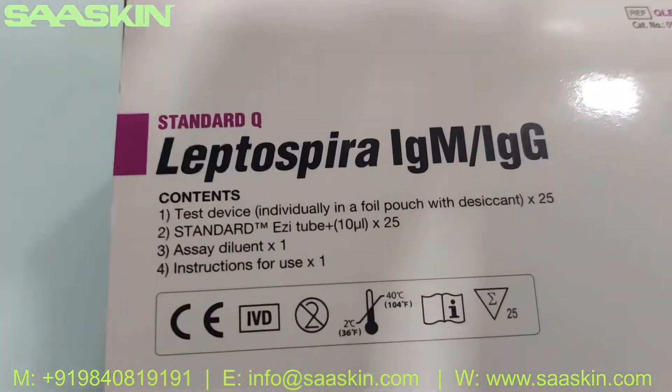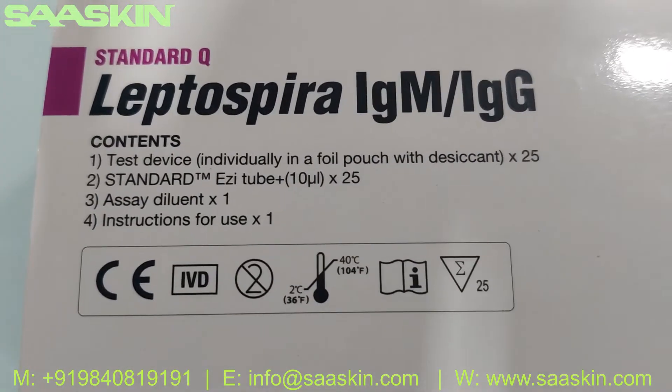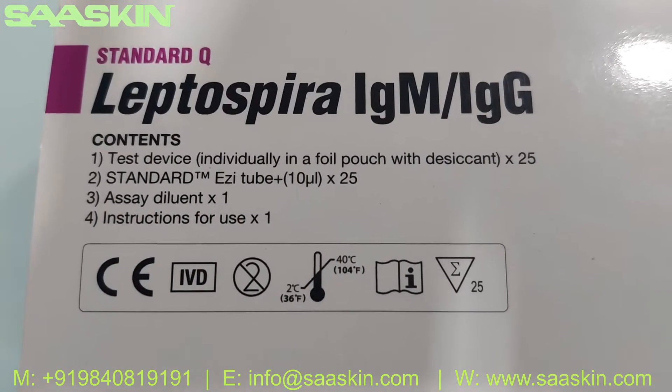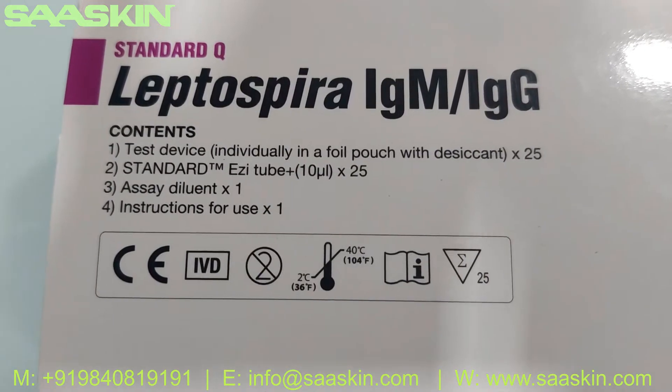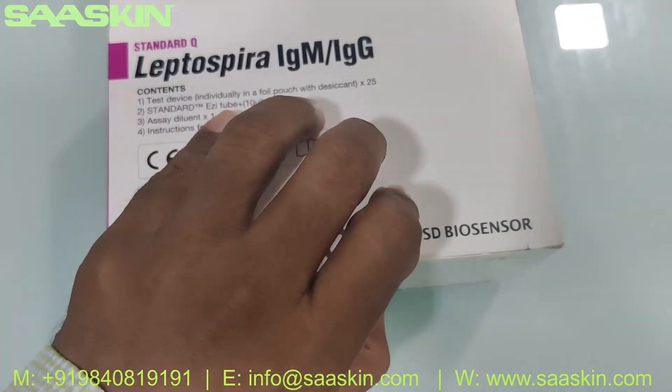You can see basically the contents inside: you have the test device, 25 pieces, and you get the standard easy tube — 25 numbers — and you get the diluent buffer and instruction for use. Let me open this box for you.